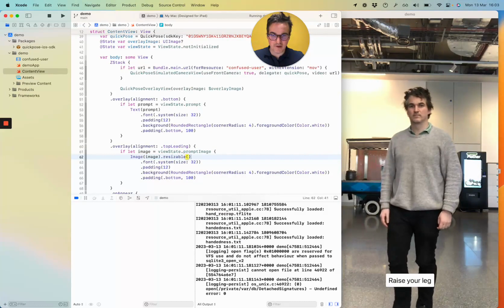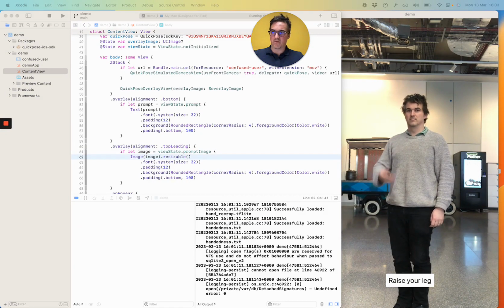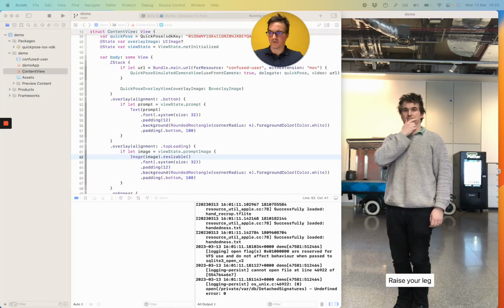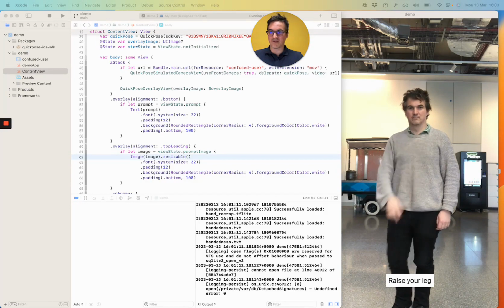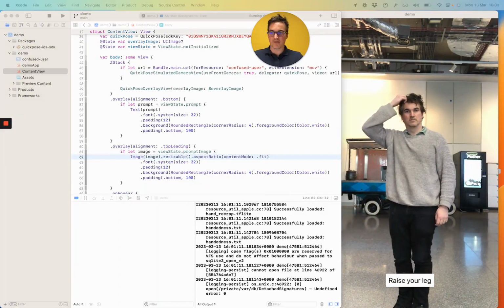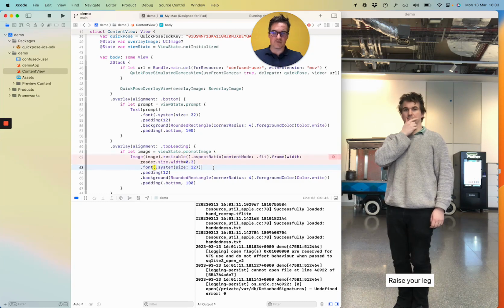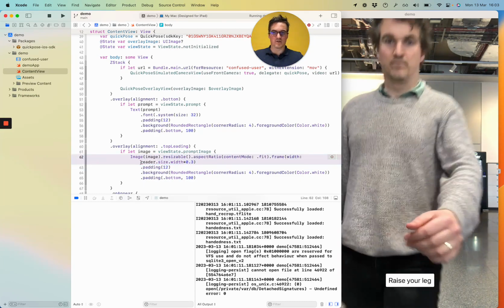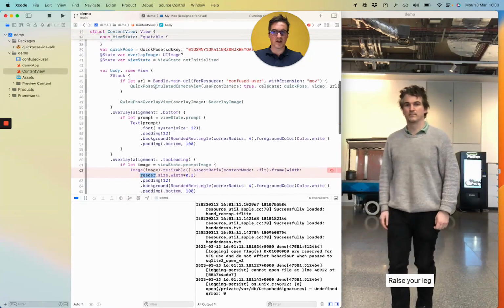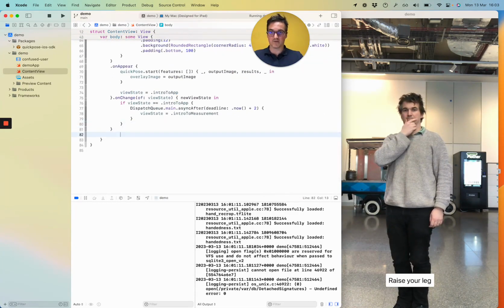so there's a bit more boilerplate we need to do on this. So it needs to be resizable. Just making sure I'm getting it right. The next step is we need the aspect ratio to be maintained when we resize it. And then we want this image to be roughly a third of the width, I'd say, kind of like peeking up here. I'm going to keep the same amount of padding. It's asking for the reader here, and that's a geometry reader. This is a standard way of measuring the size in SwiftUI. I mean, I would call it messy, but sure.